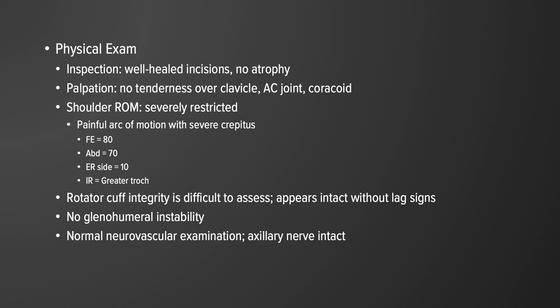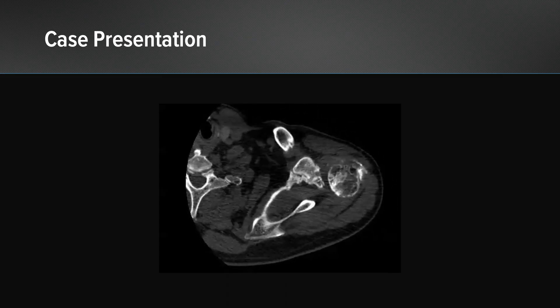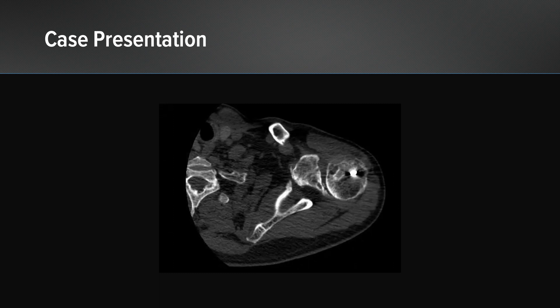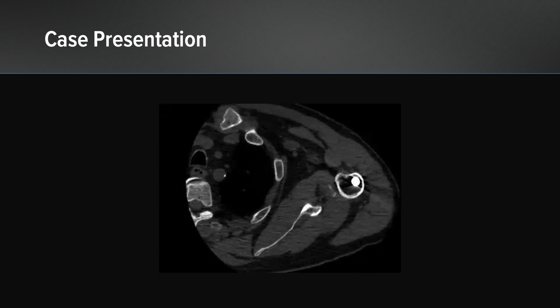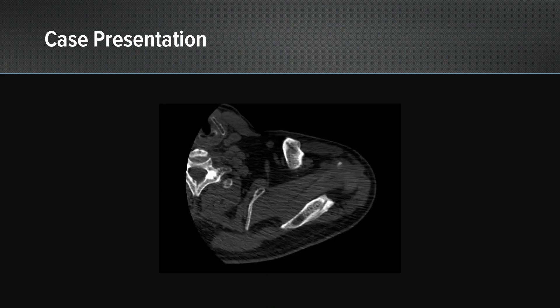There was no glenohumeral instability and he had an otherwise normal neurovascular examination, in particular with regard to his axillary nerve function. Here we see axial cuts of the patient's glenohumeral joint, and fortunately there's minimal scatter from the humeral nail. Thus we're able to still use the Arthrex VIP 3D templating system.